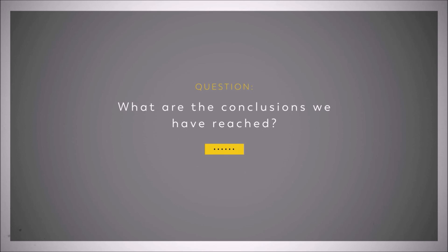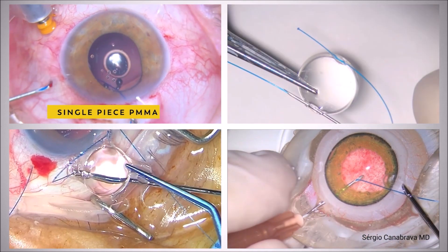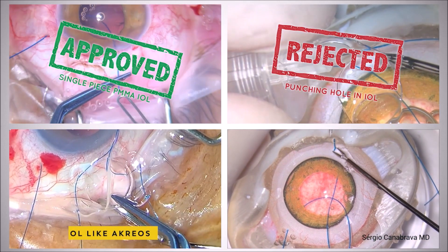What are the conclusions we have reached? We keep on going with our research, but at this point we can say that the technique with a PMMA IOL has been stable. We do not recommend punching the IOL in any axis — it's not stable.